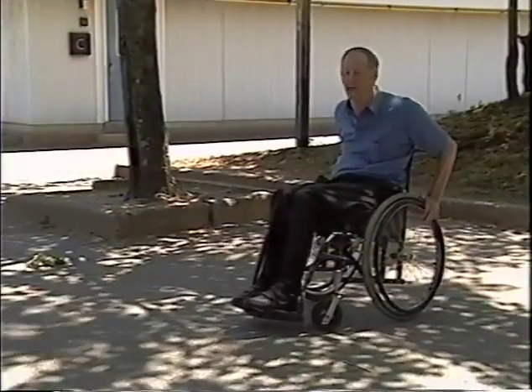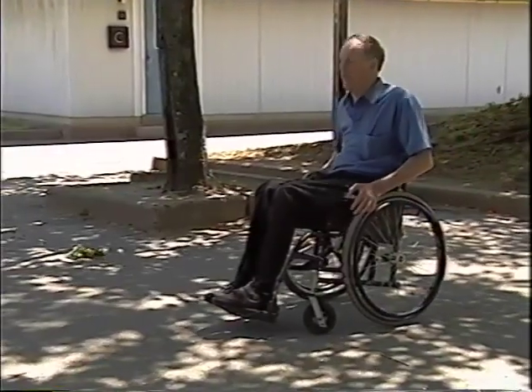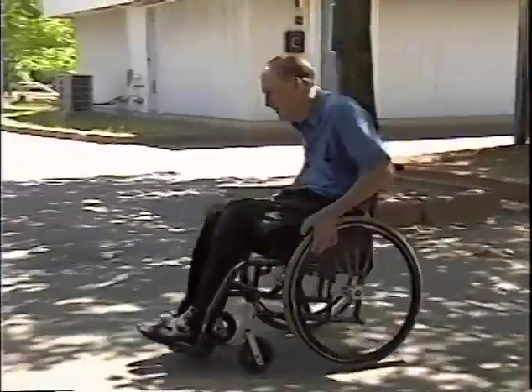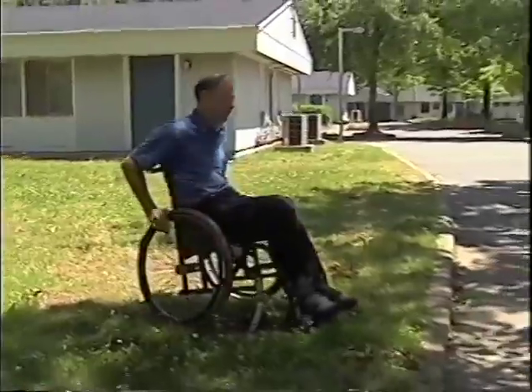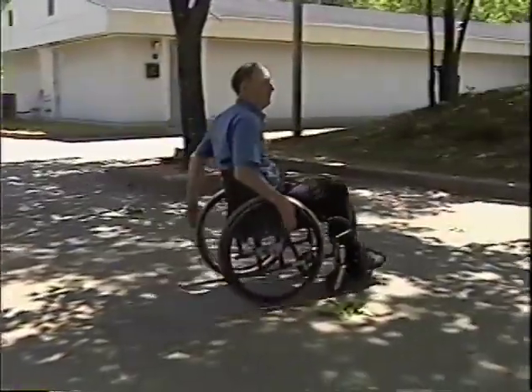Curbs, it's one thing to jump over the little wooden curb we demonstrated on, it's quite another thing, one that's in the real world and won't move. But not a big deal at all. Just pick your shot, do things right, and you should be all set. Keep your weight back on the softer surfaces. Coming up to it, keep yourself rolling, not a problem.